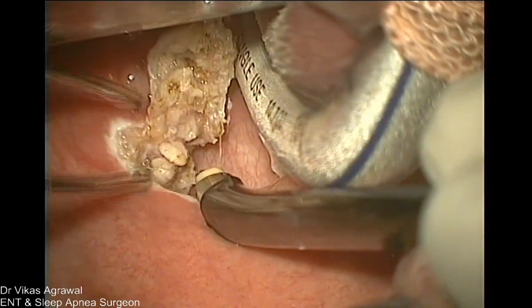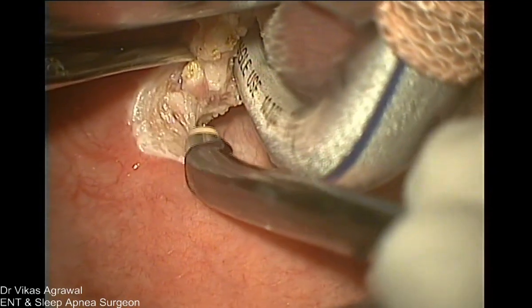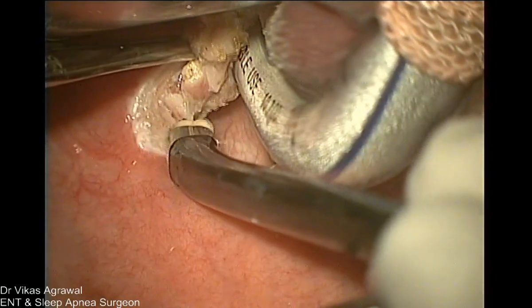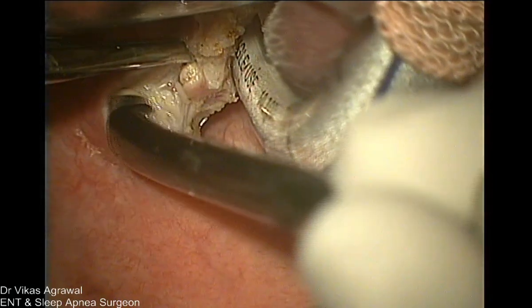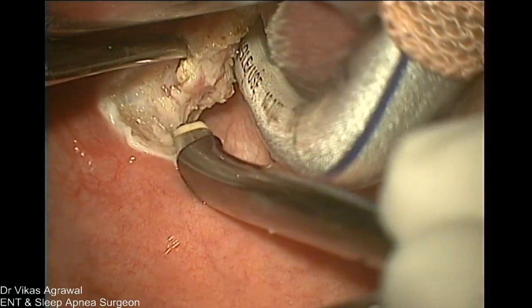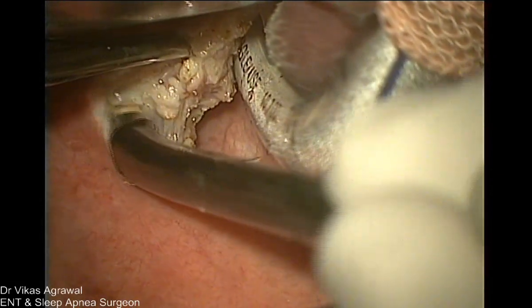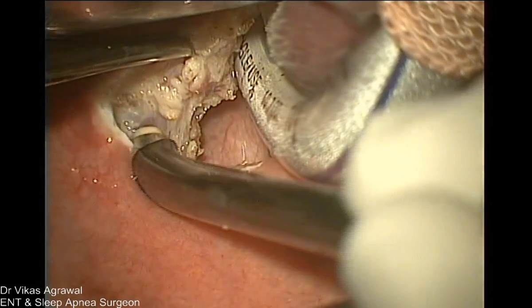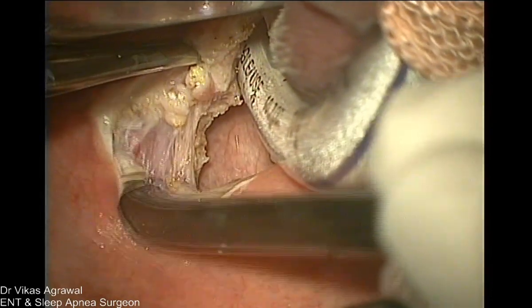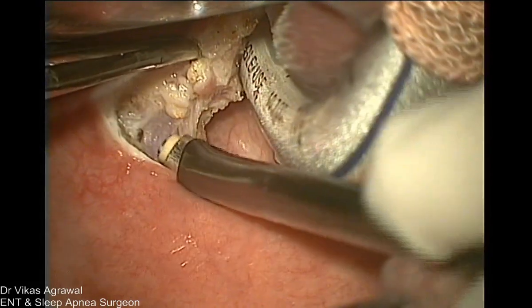Now I will get into the tonsil from here. So this is the supratonsillar pad of fat. This is the anterior pillar muscle which I do not need to remove. So I will go into the tonsil. Now this is all supratonsillar pad of fat. Now I am entering the tonsil from here. Okay, can you see that? What is that? The vein coming in. Correct. So I'll buzz the vein. You can see it very, very well.